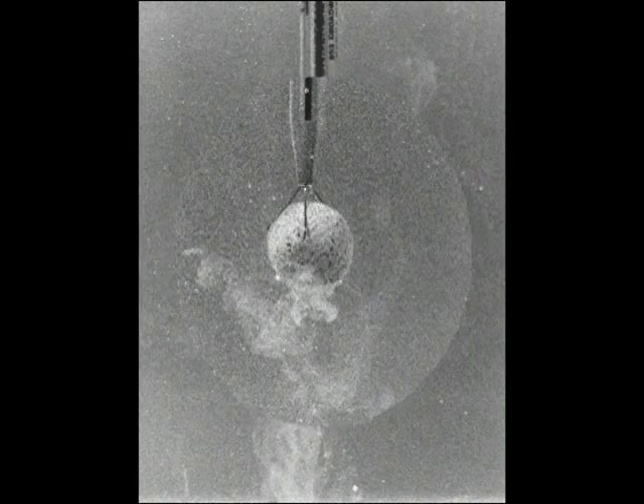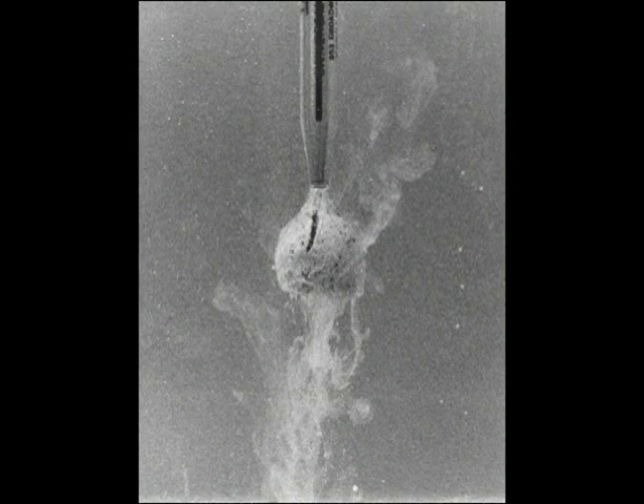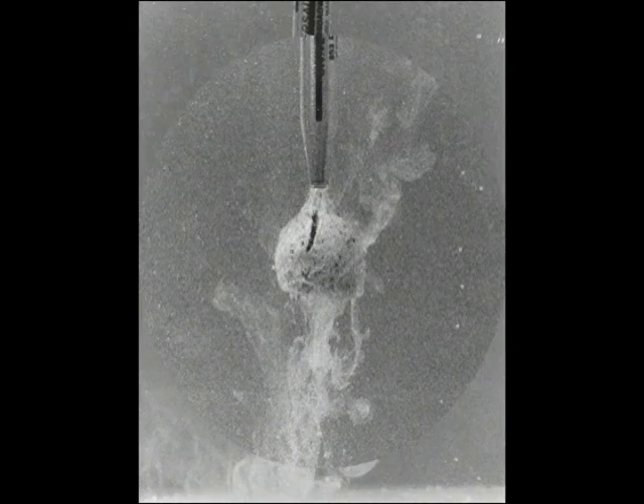Proper performance of the shock wave generator should be verified as often as possible. Stone phantoms placed in a water tank at the focus of the lithotripsy are a good way to evaluate fragmentation efficiency. Most manufacturers provide special water tanks to perform these tests. Regular maintenance by the manufacturer of the equipment is also crucial.